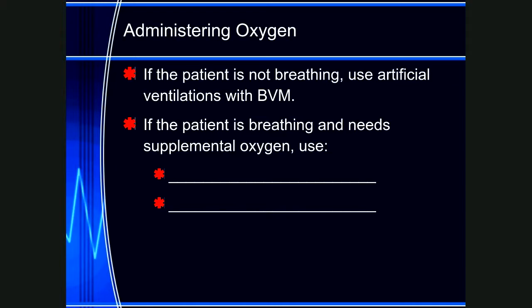We're not withholding oxygen, we're still giving them oxygen, but we're giving oxygen through a nasal cannula to a patient that has 100% SpO2, saturation of oxygen all the way down to the fingertips or the toes. At 100%, we're going to give them 2 liters a minute via nasal cannula. Once again, never withhold oxygen. Nobody's ever been charged with treating the patient with oxygen. They've been charged for not giving oxygen to a patient when needed.